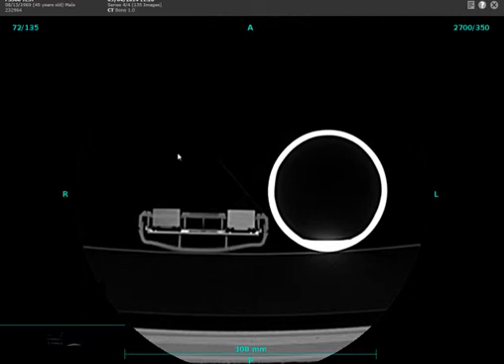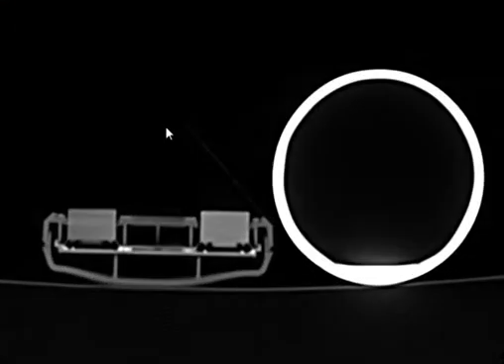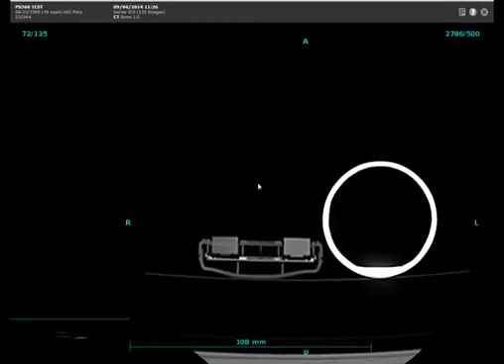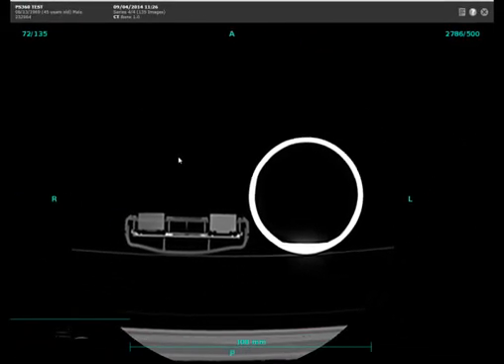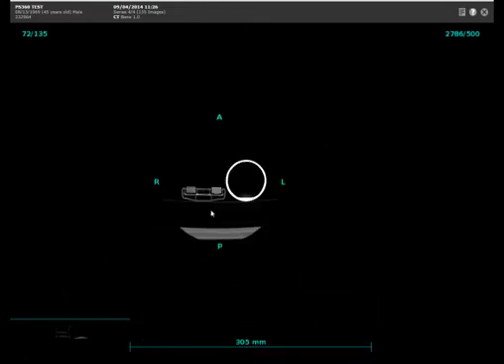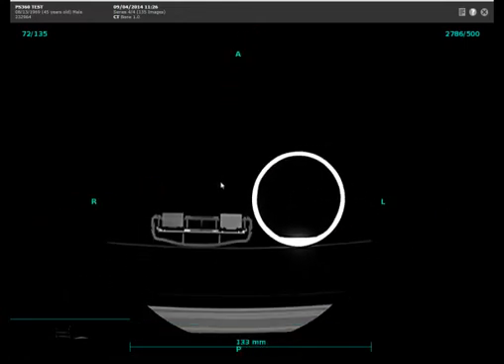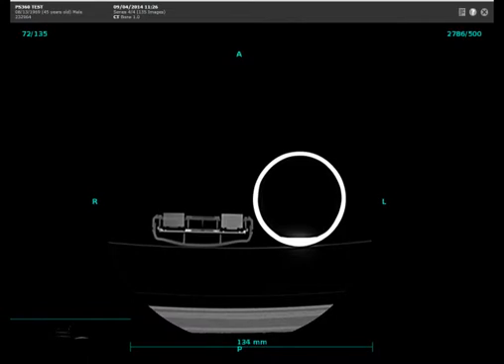If I want to do some window leveling I can right-click and drag my mouse around. If I left-click I can move the image around. I can also click both right and left buttons to zoom in and out on the image.